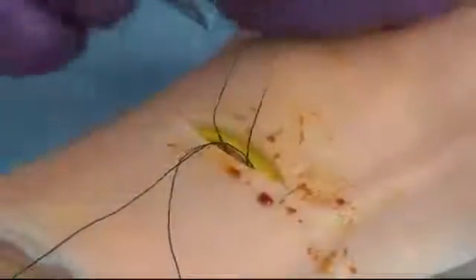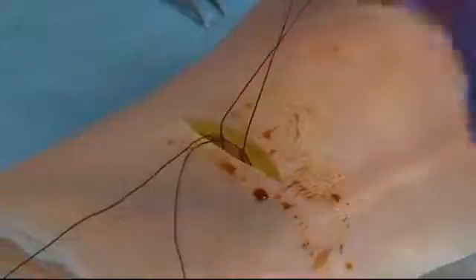Now you're going to want to tie the end that's down at the ankle, because you want flow to go towards the head. So I'm going to tie this down.